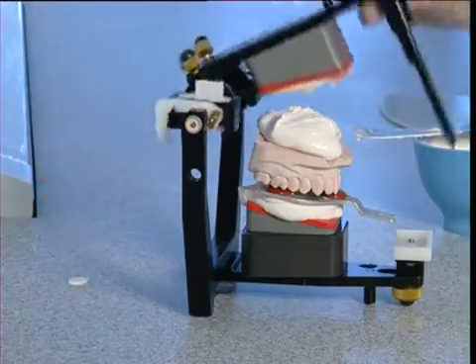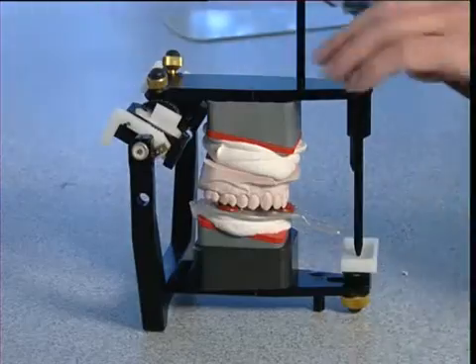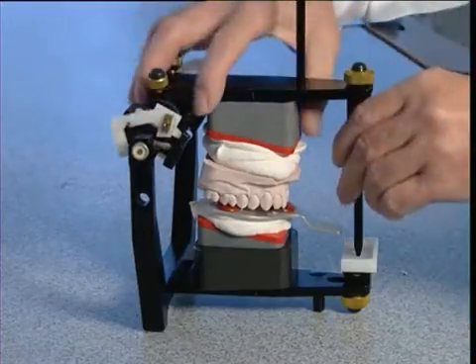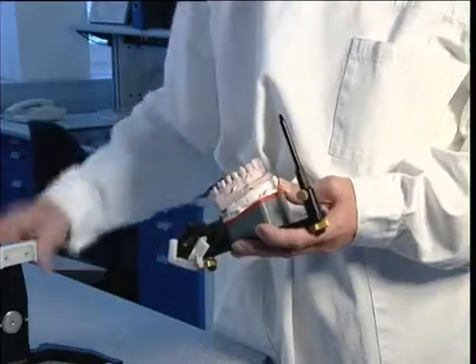The centric lock of the articulator is then locked and the articulator closed to dead center. Once the plaster has set, the centric lock is opened and the model, together with the upper member of the articulator, carefully removed from the indentations dorsocranially to prevent damage to the incisal edges.